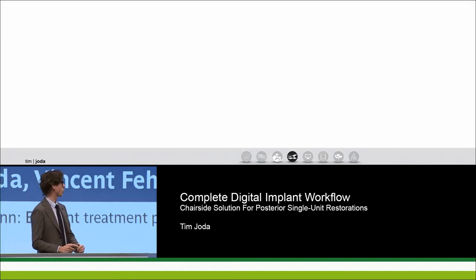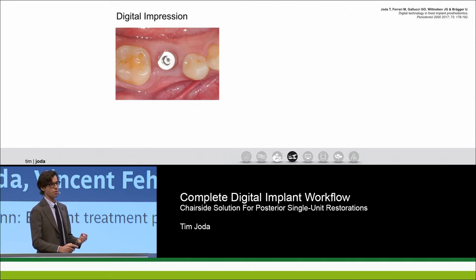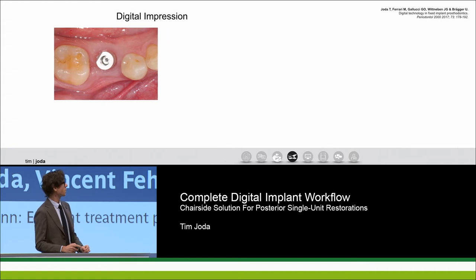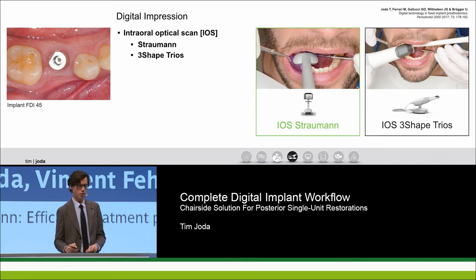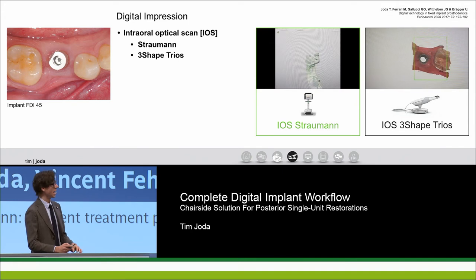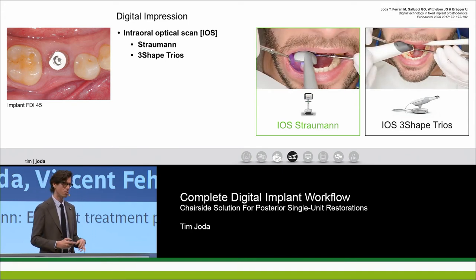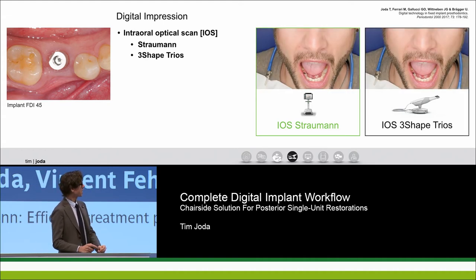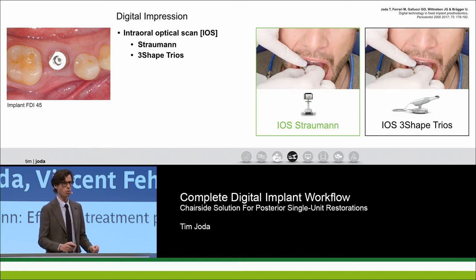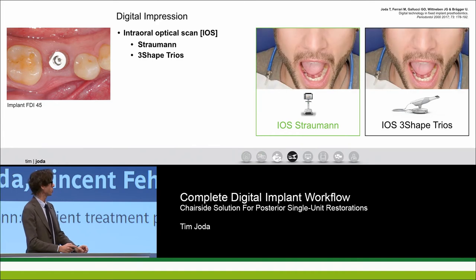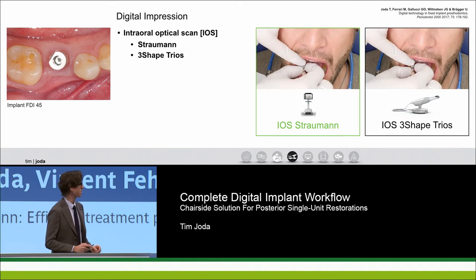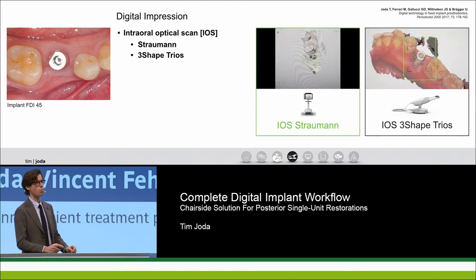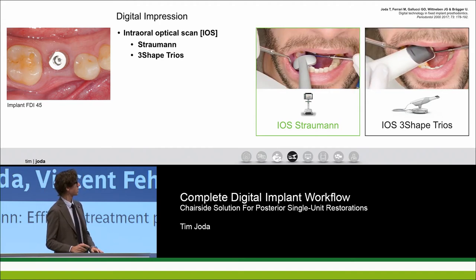The next step is to capture the three-dimensional implant position. Even though we planned it with our virtual co-diagnostics software, we need to transfer and capture it using digital impression technology. Here on video you see two handy intraoral scanning devices — really fast, simplified for both dentist and patient. You screw in the scan body to capture the 3D implant position. For posterior sites with a tissue level implant it's pretty easy. The software then automatically merges the initial scan without the scan body and the second scan with the scan body.